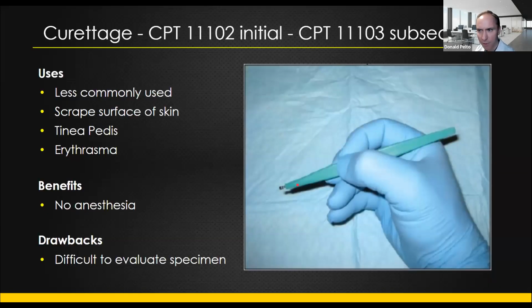So next would be curettage. Curettage is a curette. I don't know if you have these in your clinic, but basically, mine doesn't look like this. It's not open. Mine's the closed one that I have in my treatment room. And so I just curette it out. It's less commonly used, in my opinion.